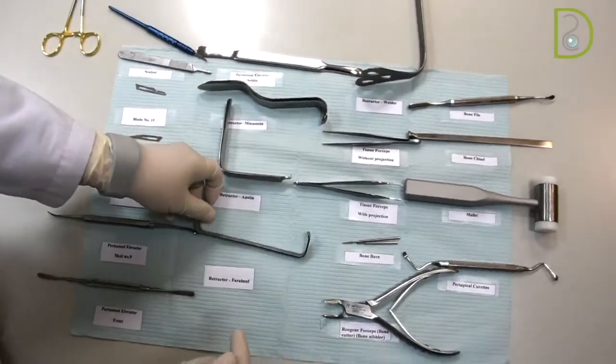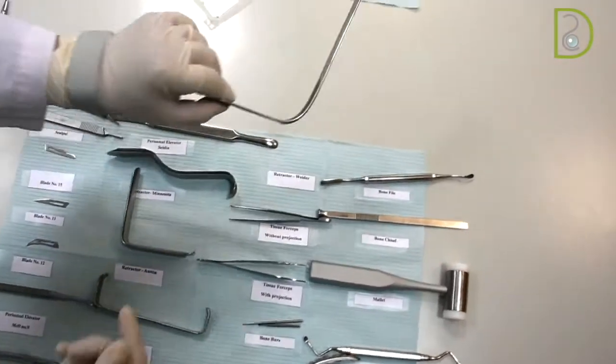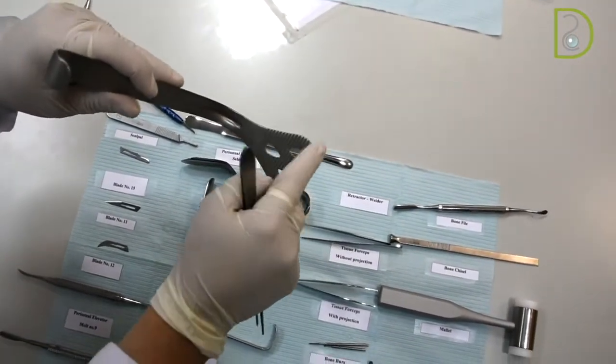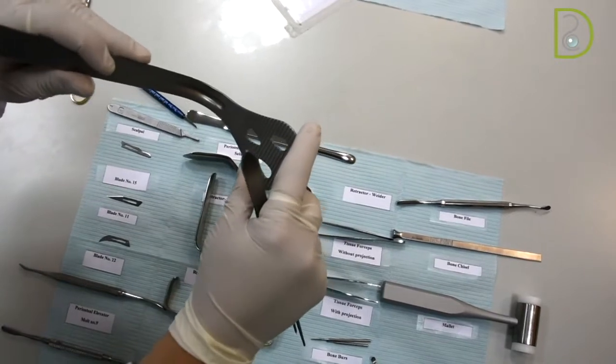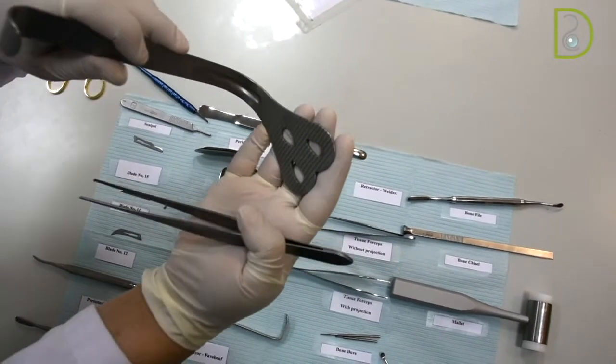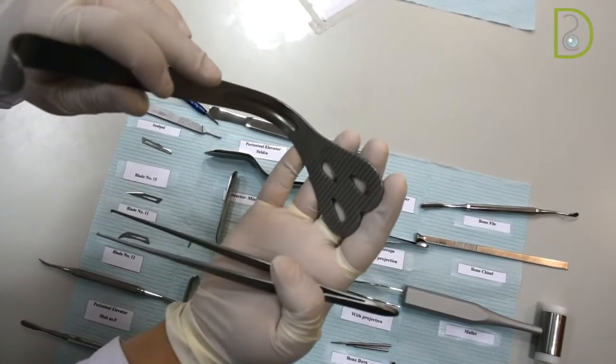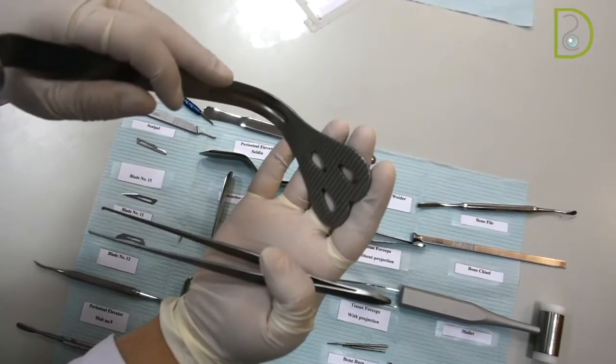And also it's good for retracting the cheek. Now Weider. Weider have a very unique design. It's like a flower shape. And this broad side is to reflect any strong muscular tissue like the tongue. This will keep the tongue away from your surgical site.